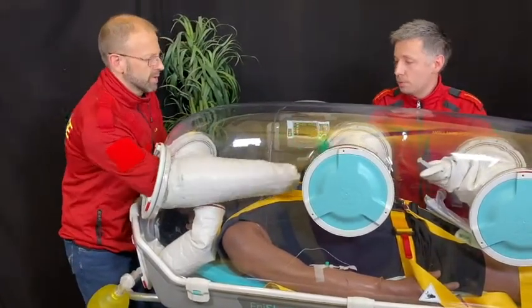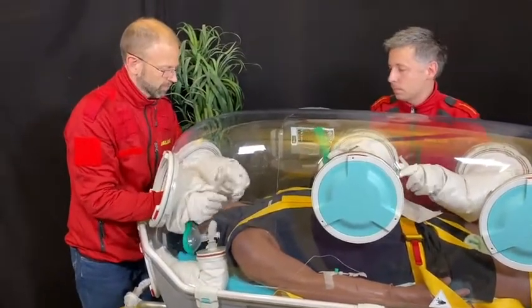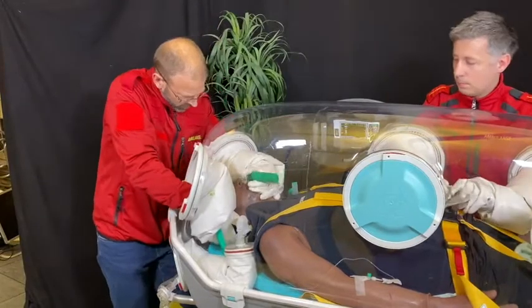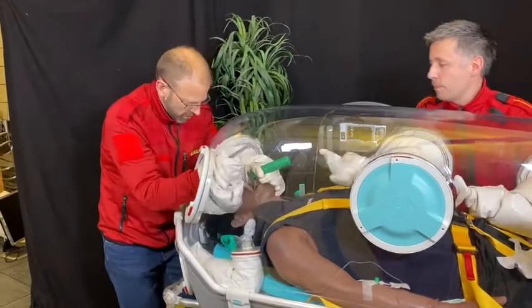Here's the laryngoscope. I have the view. Here's the tube.